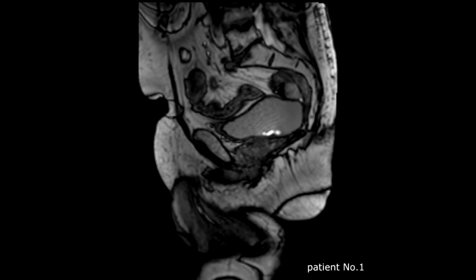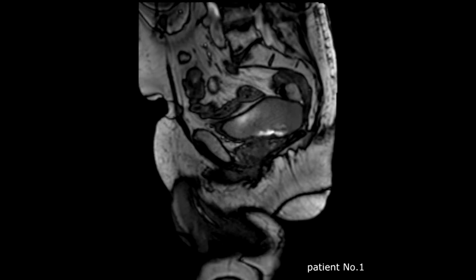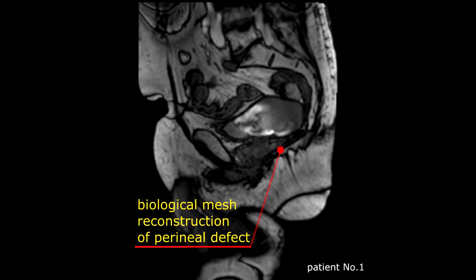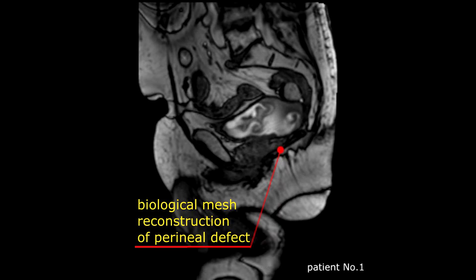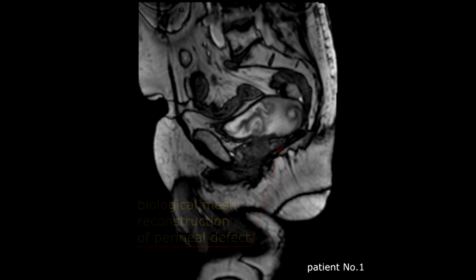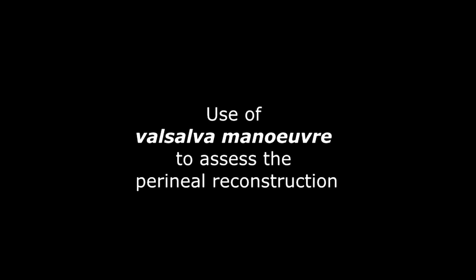This is dynamic MRI footage for a male patient undergoing an extra levator abdominal perineal excision of rectal cancer and pelvic floor reconstruction with stratus biological mesh. A red coloured pointer points to the reconstructed pelvic floor. The pelvic floor plate does not show any herniation or abnormal descent at rest.